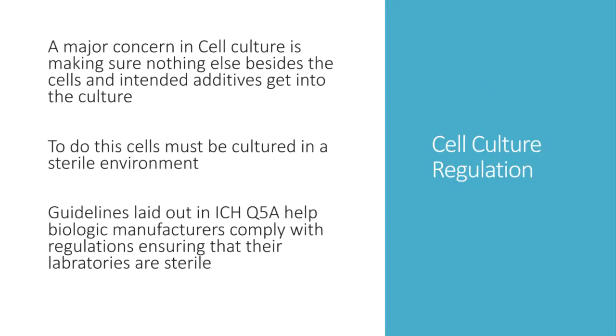Cell culture is also subject to regulation, as any contamination in the cell culture could threaten the drug or the viability of the drug. To do this, cells have to be cultured in a sterile environment where there's no chance of anything else getting into the culture besides the intended nutrients and other additives, as well as the cells.